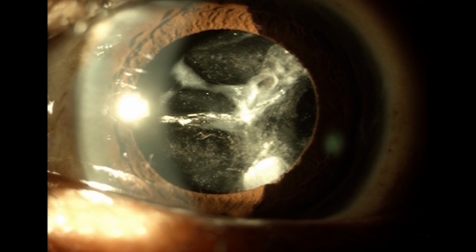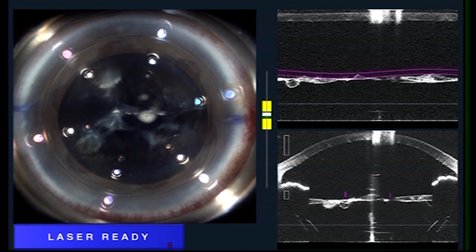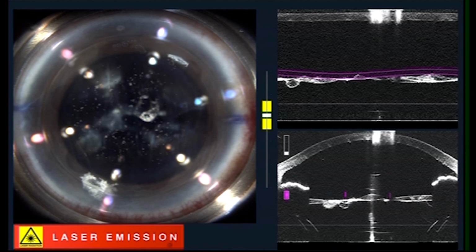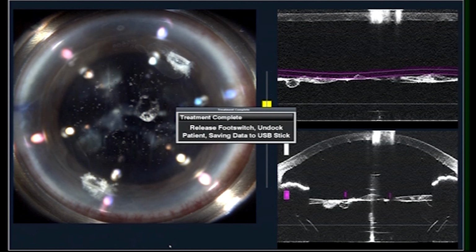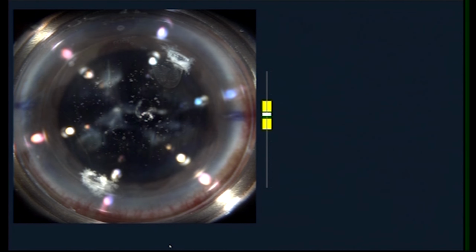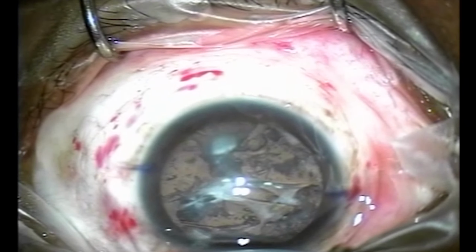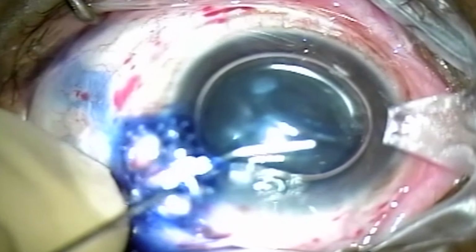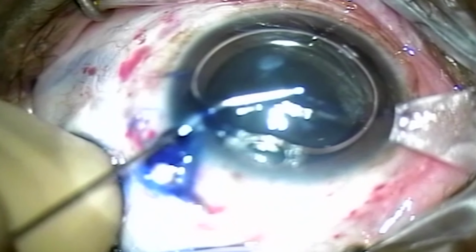in such cases. So I applied the femtosecond laser using areas of separated capsules in the maximum potential spaces, and yet it miserably failed, leaving me in a more precarious situation of certain cut areas of the capsule in an already difficult situation. So I moved this patient to the surgical microscope and started making a manual plan as I go. I stained the capsule, trying to make sure for future visibility and maneuvers.